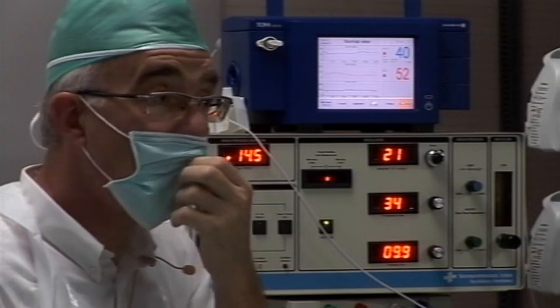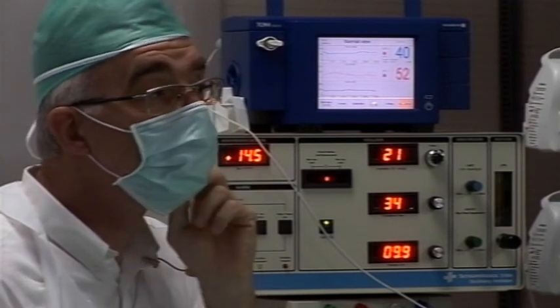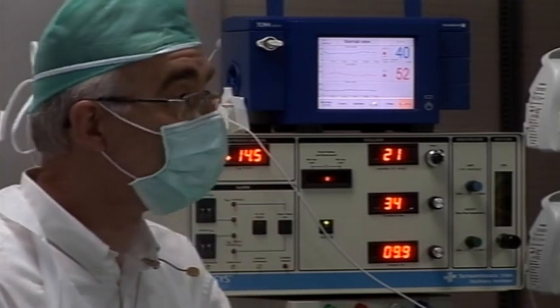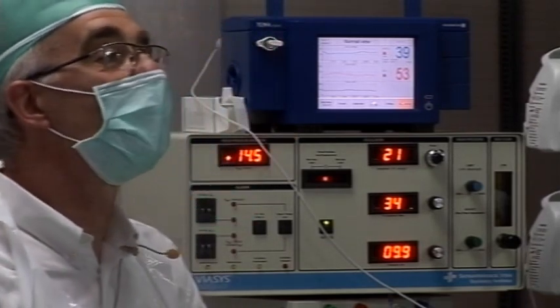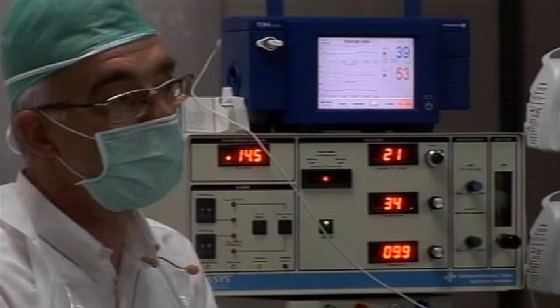Do you have other questions? Are you still skeptical? The problem with adult people, I don't know if there are adult people here, or a pediatrician, I see you. They never do early intervention. It cannot work then. And if they do, they work on the already injured lung. So it is less evident to see differences.